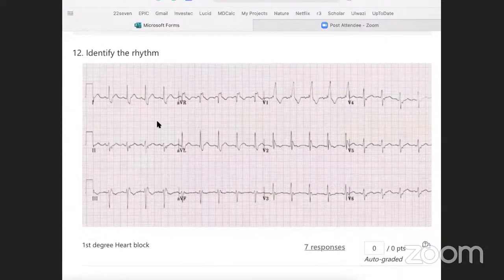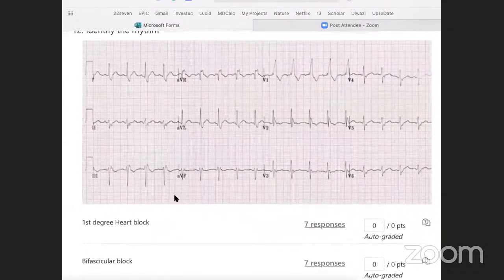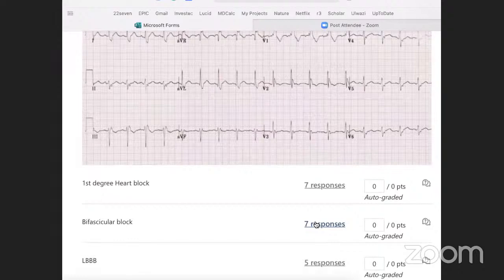Whenever I look at an ECG and I see a bundle branch block and I see axis deviation, I know that this patient is in serious trouble, as it's a bifascicular block, meaning that there is a right-sided bundle branch block and one of the branches of the left bundle, whether anterior hemiblock or posterior hemiblock, is also blocked. It's a high-grade block, and the patient could go into AV dissociation and heart failure. So this is a bifascicular block, as we did have 7 correct responses here.